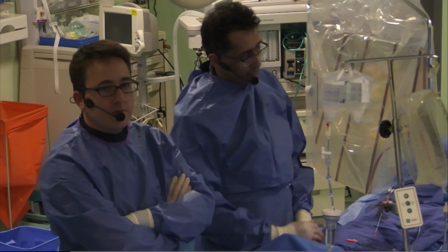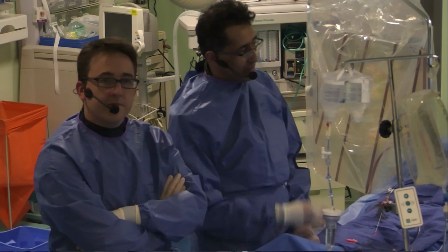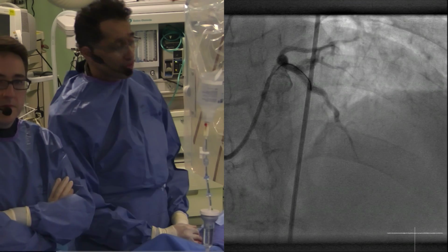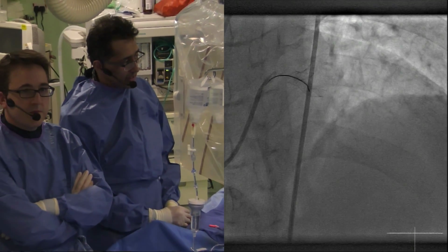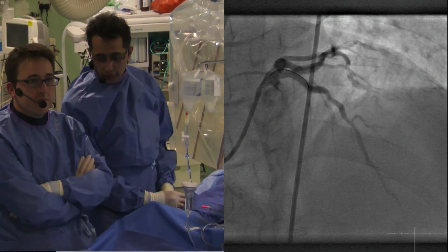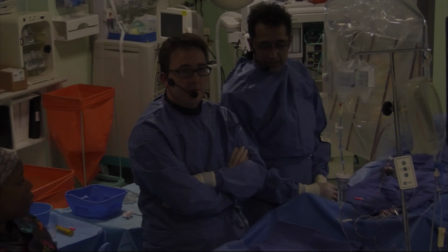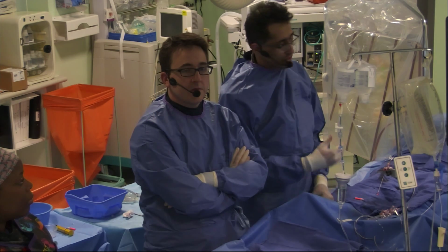And I've got a wire, which I don't know whether you can see on the angiogram. The tip of the wire is inside the proximal stent. But the key to it is that the measuring part of the wire, which is at the end of the black part more proximally, is in the left main stem. It's before any stenosis. It's hovering in the main.